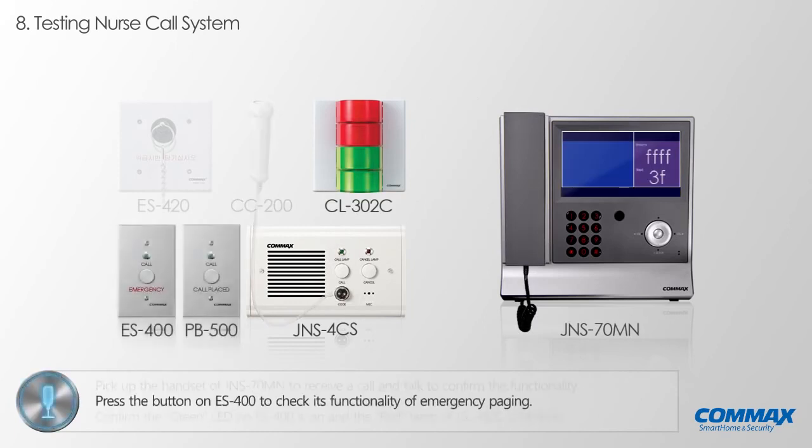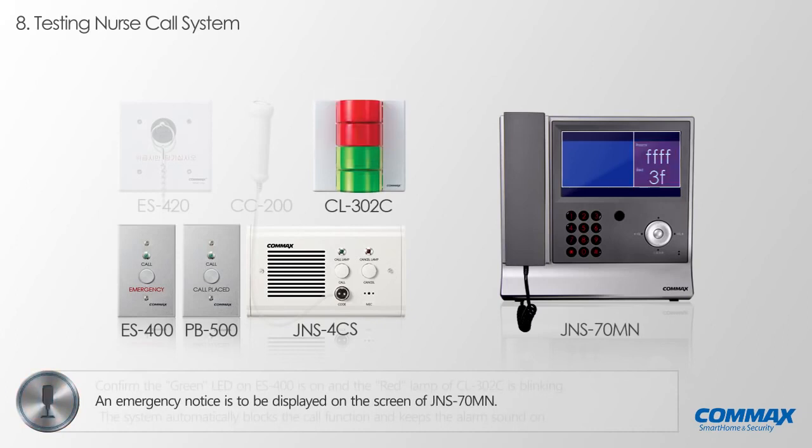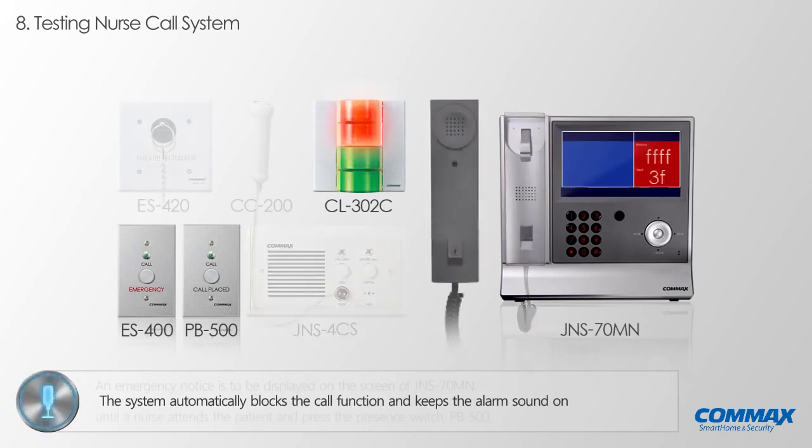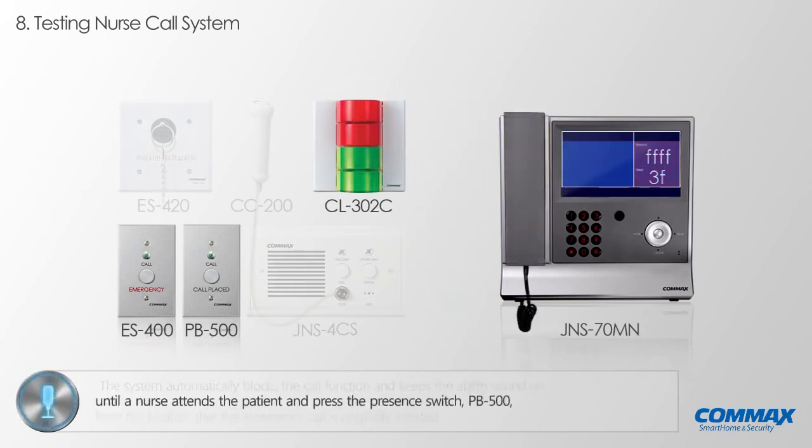Now please press the button on ES400 to check its functionality of emergency paging. As the button on ES400 is pressed, the green LED on ES400 is on and red lamp of CL302C starts blinking. An emergency notice is to be displayed on the screen of JNS70MN. In this case, the system automatically blocks the call function and keeps the alarm sound on until a nurse attends the patient and presses the presence switch PB500.